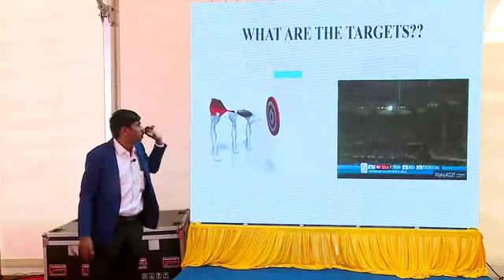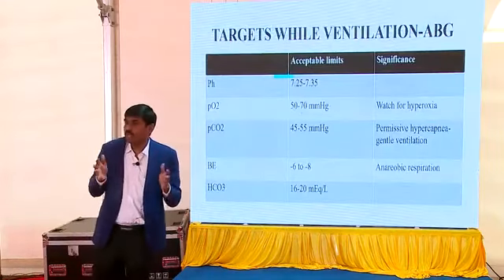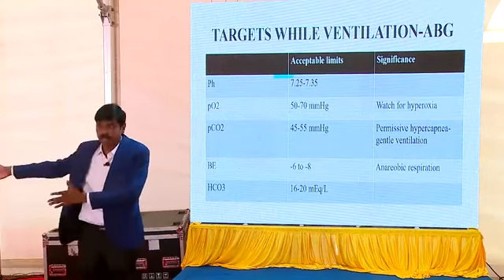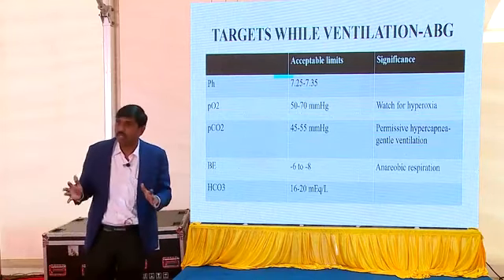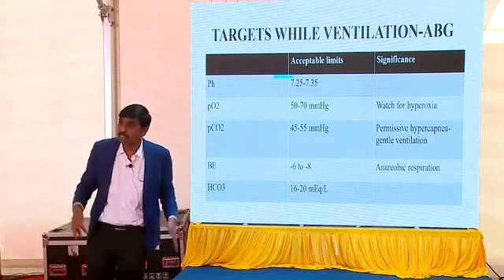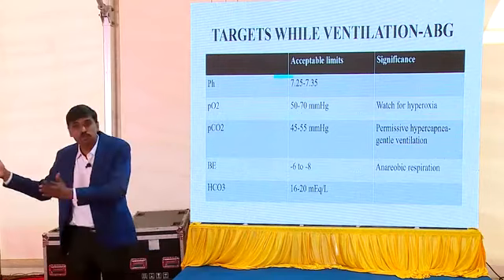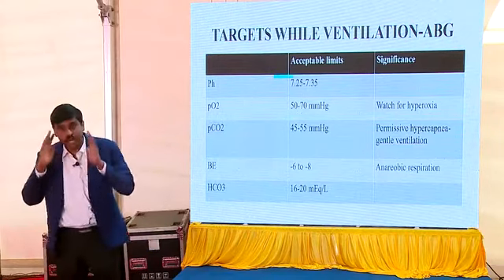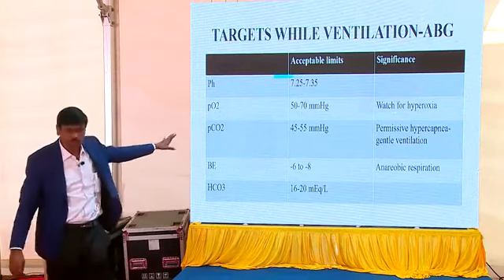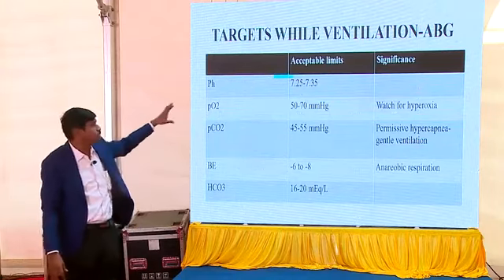Now, finally, with these terminologies, knobs and modes you've got, what are we actually working on? Finally, we need the baby to go home safe. It's like a sport: finally you need to win the game, but you're not looking at the far end. As Dhoni says, you look at the process. So along the way you have small targets, you try to achieve those targets, and ultimately your end goal will be reached. Here, what you're going to look out for is the ABG.